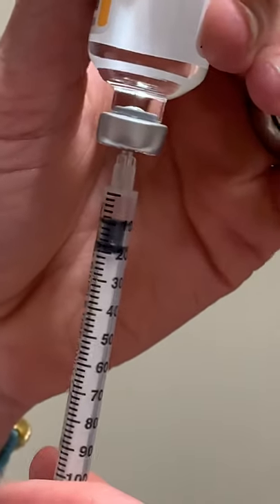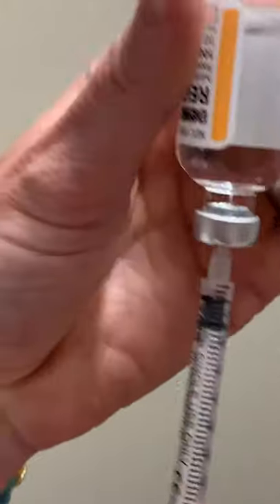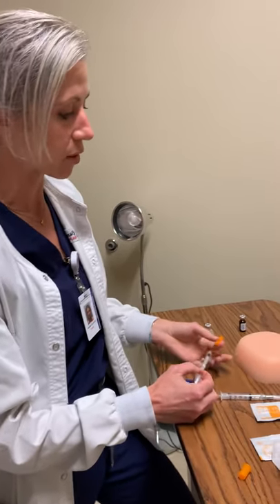We're going to go all the way up to two units. When I have my two units, I can recap this. And what did I say I was going to do? I'm going to verify with another nurse. I want to make sure that I've got the correct dosage. I would bring a nurse in — verify that Ms. Motley is going to be getting two units of insulin — and let them eyeball it to make sure you're giving the appropriate dose.